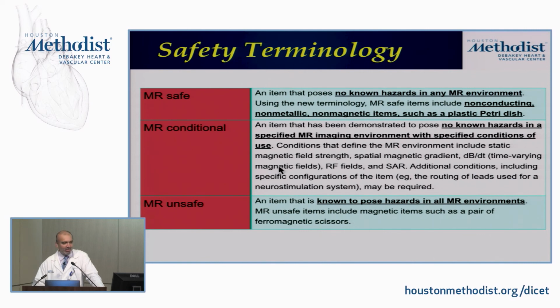Okay, it could be MRI conditional, and what that means is that it has no known hazards in a specified MRI imaging environment with specified conditions of use. All right. So when we talk about pacemakers that are MRI safe, they're not really MRI safe. They're labeled as MRI conditional. Pacemakers or defibrillators or any device that's put into a patient. And obviously MRI unsafe is something that's known to be hazardous that you don't want to do.